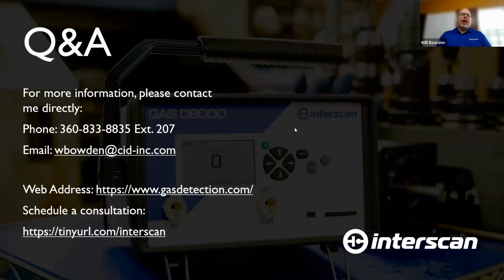Now, what I will always say is, if you have an event where you had a leak, an accident, et cetera, where the sensor was exposed to extremely high levels of a particular gas, I would definitely recommend replacing that sensor, because when a sensor is hit with a slug of gas like that, that can affect the life and performance of it and degrade it very quickly. So in situations like that, I always recommend be on the safe side, go ahead and replace the sensor if you've had an incident.